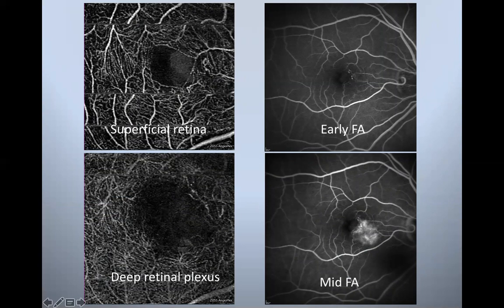And then here's the OCT-A. This is more of a type 2 type of macular telangiectasia, where we don't have the aneurysmal changes as obvious on here, some small ones, but you can see how large the foveal avascular zone is here, and there's that cloud of fluid in here, and then the deep retinal plexus shows a very large area here.